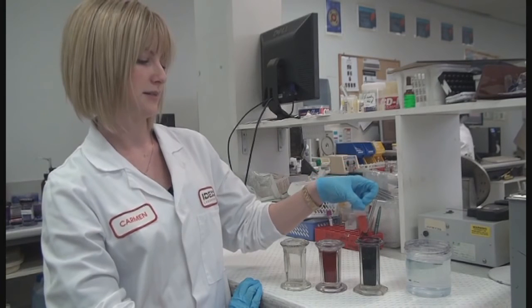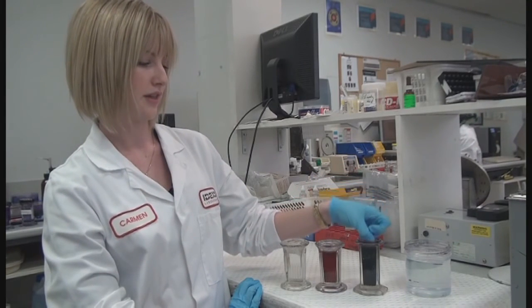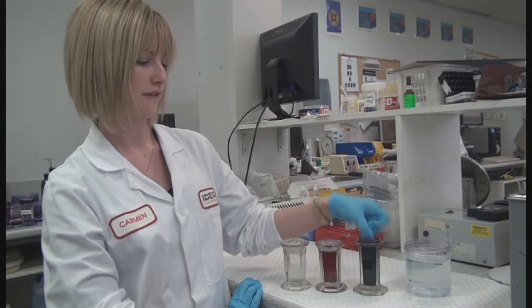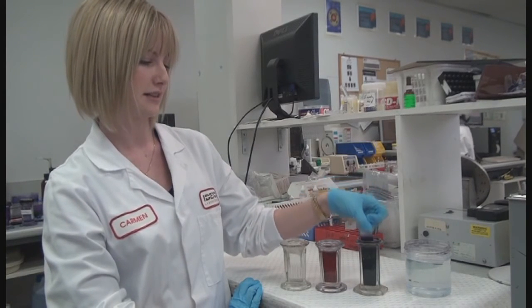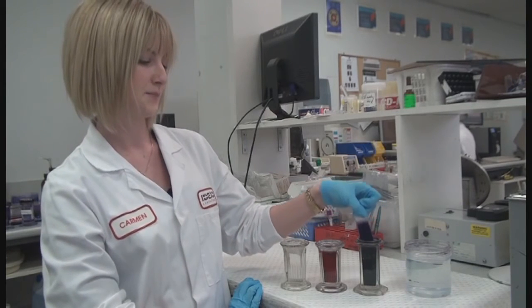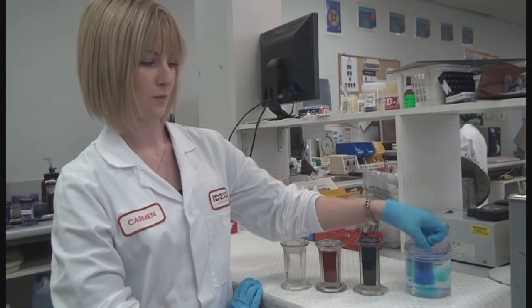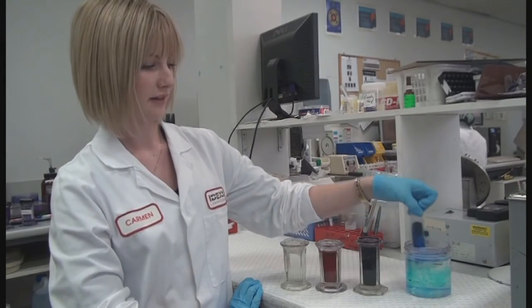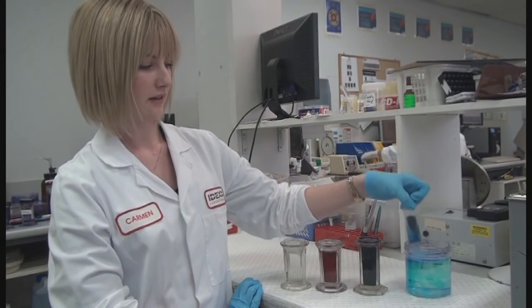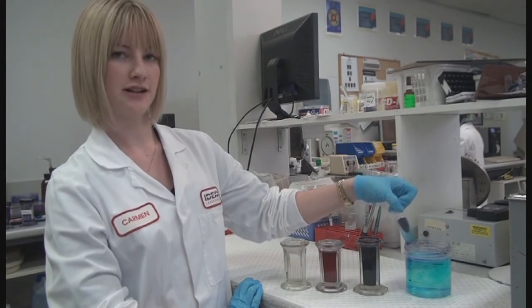And then 10 dips in dip 2, and then rinse off in water. And there you have your stained slide. Just let it dry and it's ready for reading.